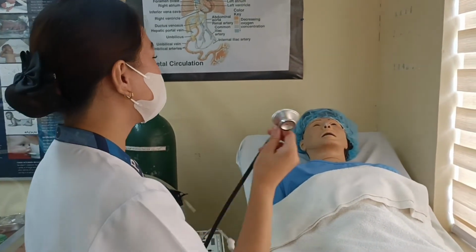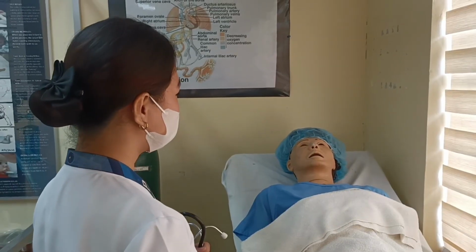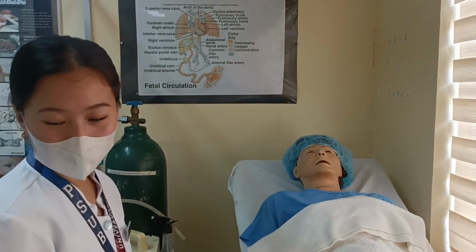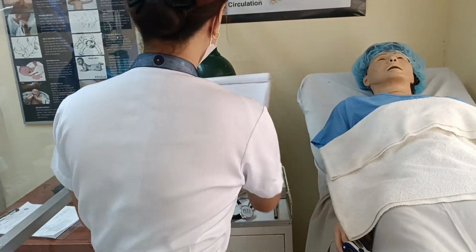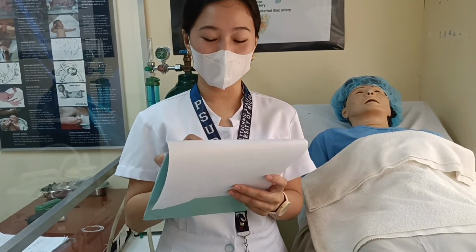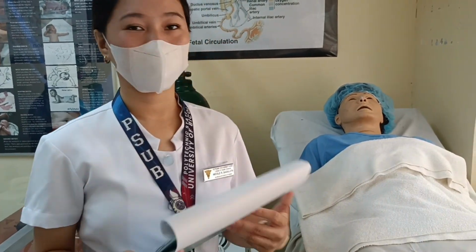So, ma'am, how do you feel po? Ano pong nararamdaman niyo pagkatapos na ma-suction? Do you feel relief po? Okay. Thank you, ma'am. So, we are going to perform hand hygiene. Then last, we are going to document. We are going to document the characteristics of secretions, the duration of the suctioning, and we are going to teach the patient. So that's all.